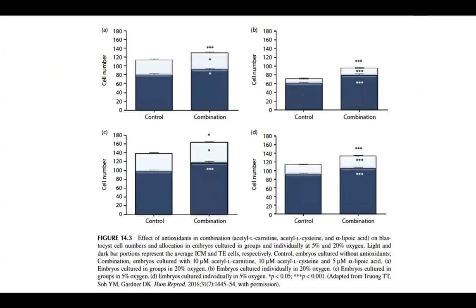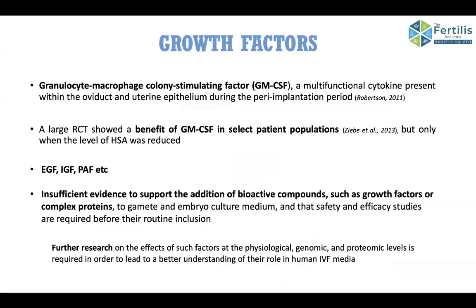Also, the effect of antioxidants works much better in incubators with 20% oxygen compared to incubators with 5% oxygen. So Lakshmi will be taking all these studies. Similarly, we have growth factors such as GM-CSF, EGF, insulin-like growth factor, and platelet activating factor. So many factors are being tried in the latest new generation media.